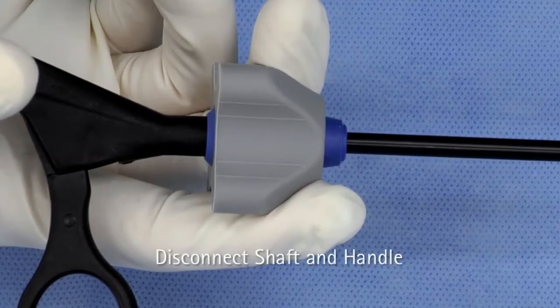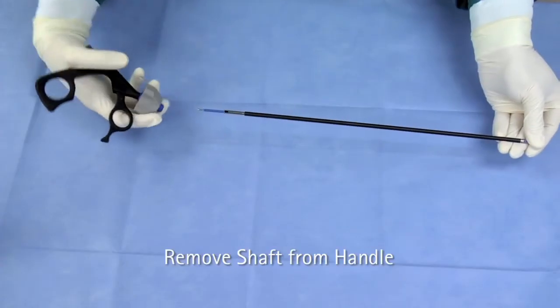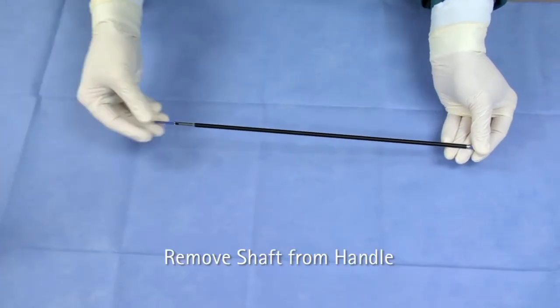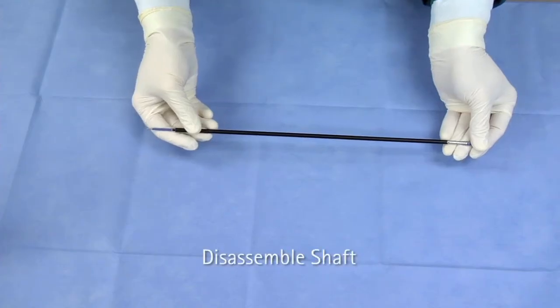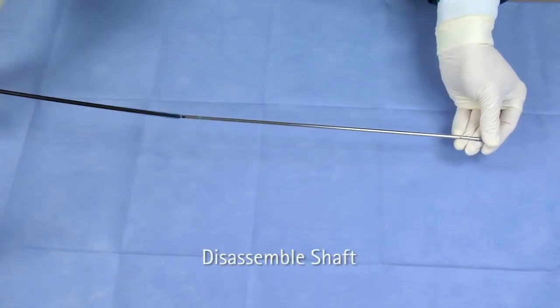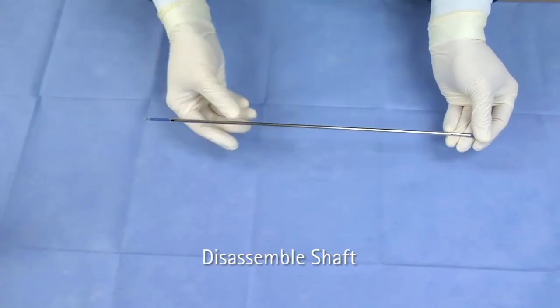Pull the rotation knob back and hold it in this position. Hold the jaw insert at the tip and pull it out of the handle. Do not touch the movable part of the handle. Hold the jaw insert at the tip and remove the outer insulation tube, then remove the inner metal tube.